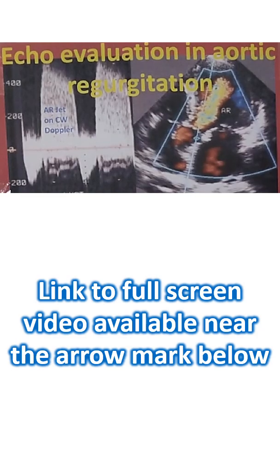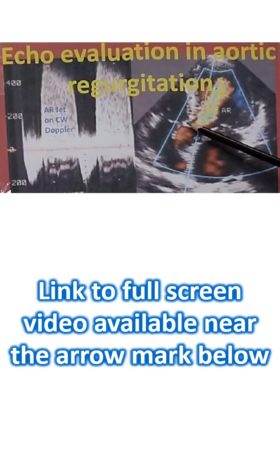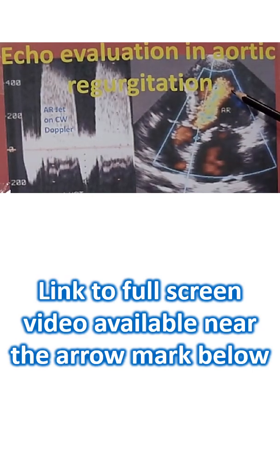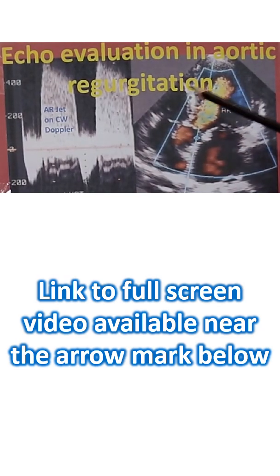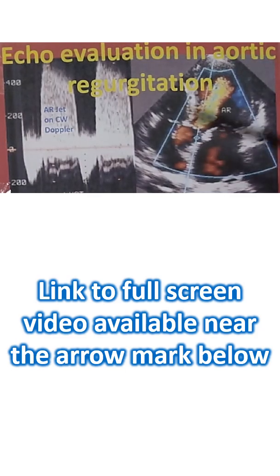This image shows evaluation of aortic regurgitation from the apical 5-chamber view. This is the aorta, left ventricle, left atrium, right ventricle, right atrium. So this is known as the 5-chamber view.